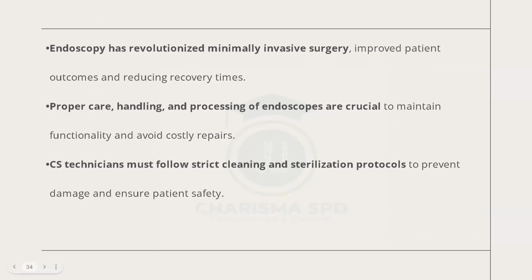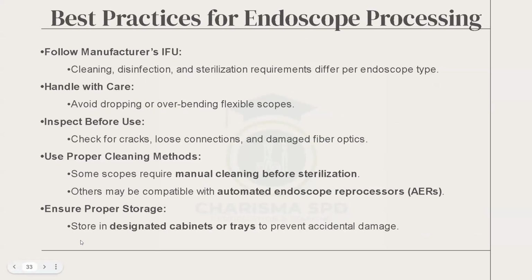Again, best practices in doing that. IFU. Handle with care, don't drop it, don't burn it, inspect for cracks, loose parts, bioburden, and then select proper cleaning materials to do that, and then use the right sterilization method so that it will not what? Destroy or damage it, okay? And then also store it in the right place that it is supposed to go.